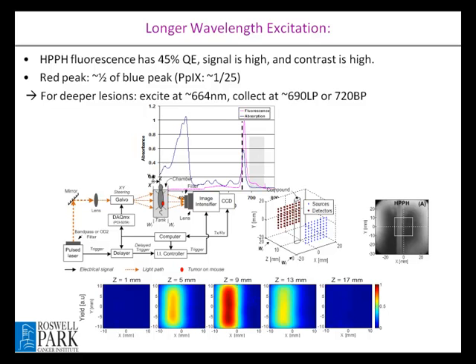We showed this for this particular case with the tomographic setup, where you scan the laser on the source plane with the Galvo scanner, and the light source will be on this plane. And then with a CCD camera, we also use the CW CCD. Then you can reconstruct it through the whole tank, and you will be able to see good contrast in deep tissue imaging.